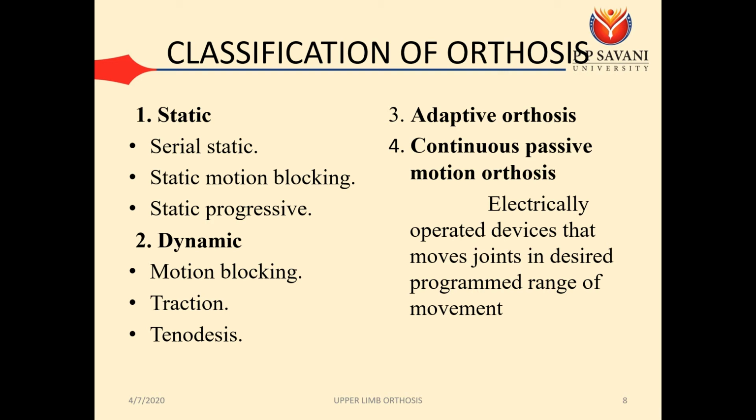So static is again divided into serial static, static motion blocking, and static progressive. Dynamic is divided into motion blocking, traction, and tenodesis. And third is adaptive orthosis.